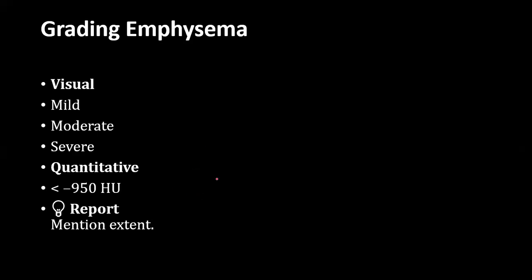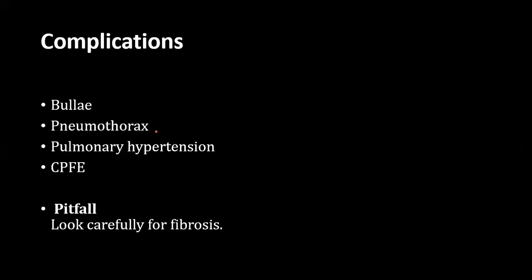Now, while reporting emphysema, you must mention the grade or stage, whether it's mild, moderate, or severe. It's very important to mention. It would be very helpful for the clinician, especially if they go for PFTs on those patients. So your report would be very helpful for those clinicians.